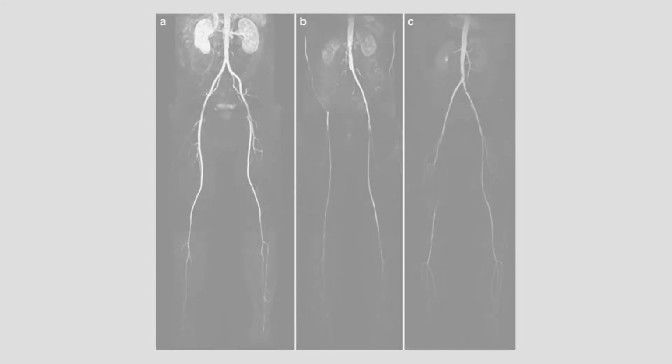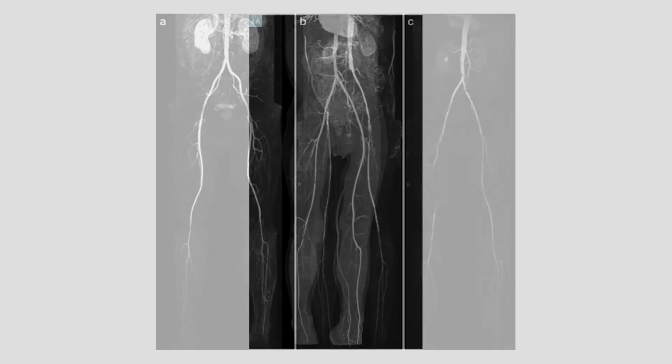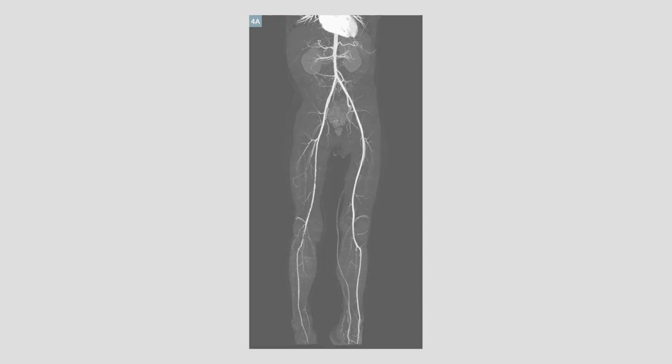We actually perform a lot of those here, with great success and great image quality. It's an amazing study. Let's say some patients are diabetic. They're unable to have an iodine injection when they go for an angiogram. When a patient is having a routine angiogram, they inject iodine. If the patient's diabetes is very high, it's dangerous for the kidneys and could shut them down. This is where MRI basically comes in.